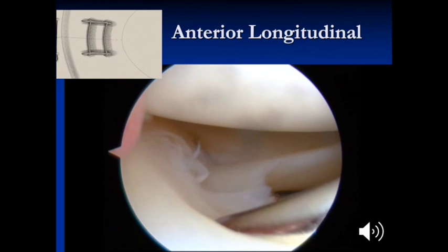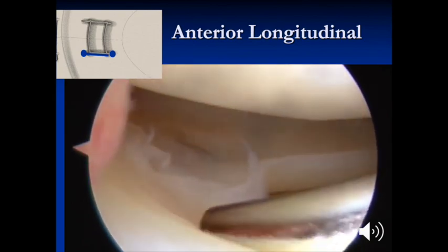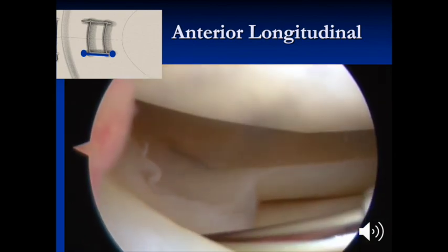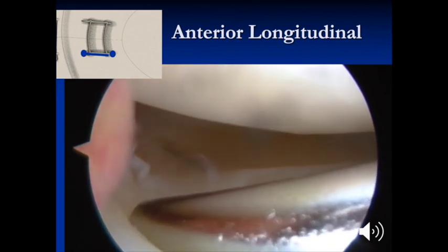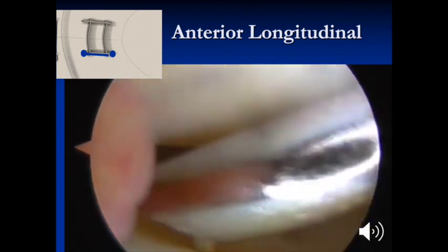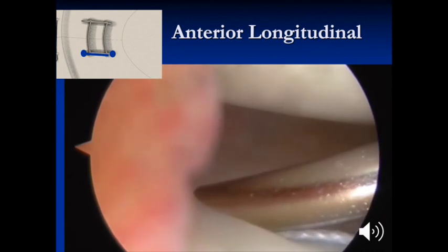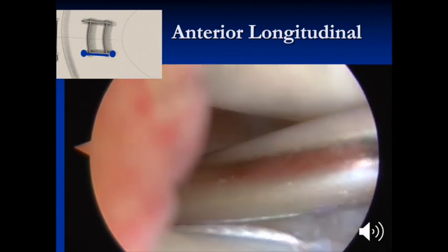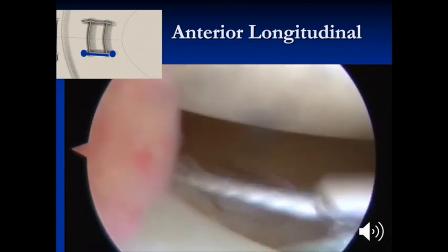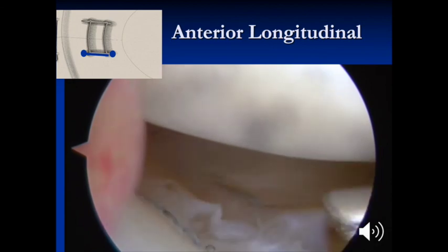The anterior longitudinal repair is then performed. The tear is oriented with the dotted red line. First, the inner suture will be placed with a meniscus needle, anterior to the full radial tear at the inner aspect of the meniscus. The guide is then advanced to the more peripheral outer part of the meniscus and the second needle is passed. The two longitudinal reinforcing sutures are now finished.